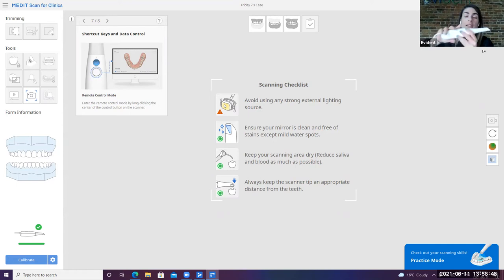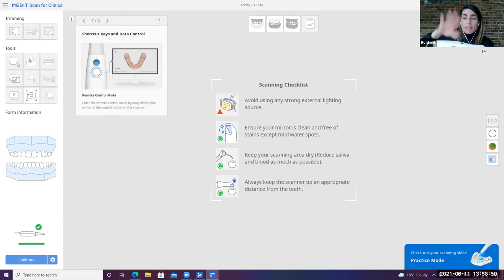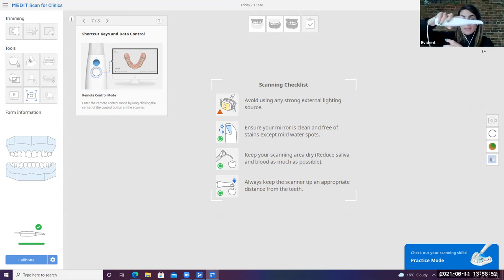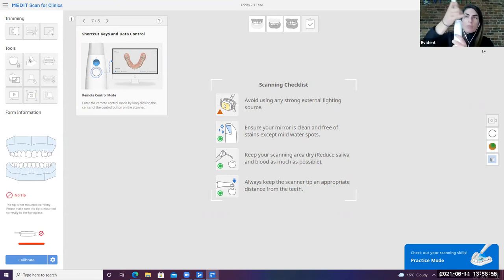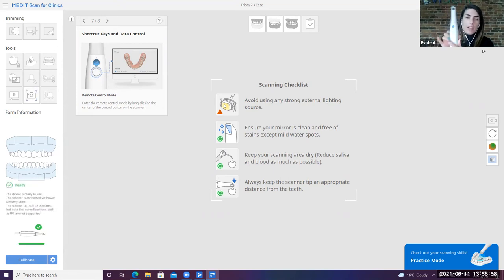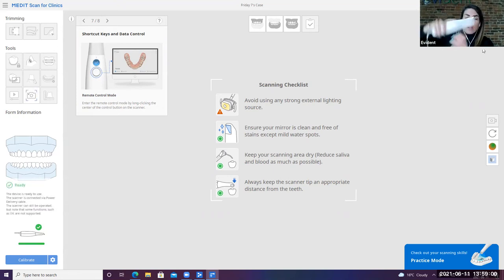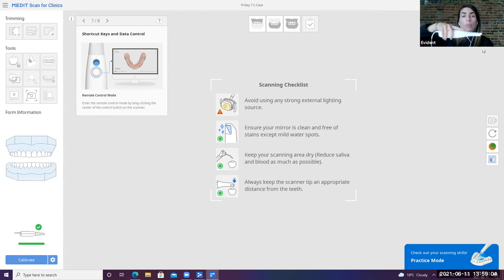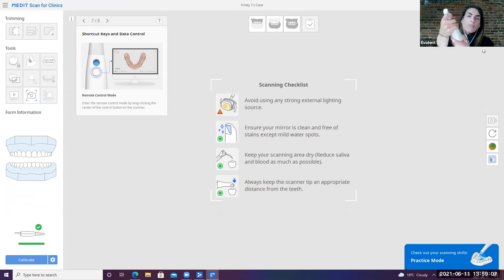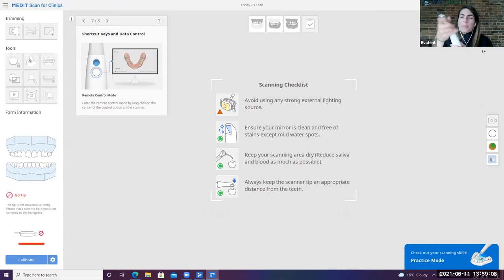The other cool thing too, is that it is a bit smaller. I have hands the size of an 11-year-old. I find that it fits quite nicely in my hand. But what's super cool is that you can actually take the tip and rotate it 180 degrees so that you can maintain that ergonomic grasp on your scanner. And then you can go ahead and scan the upper with a little bit more ease. So it's a really, really great and neat, helpful feature.